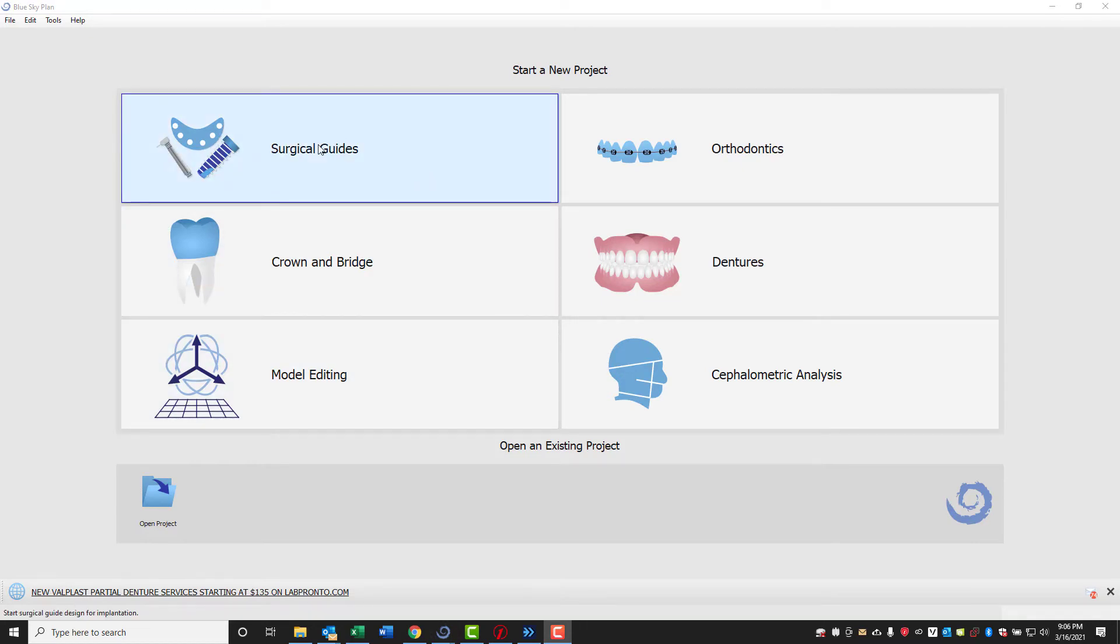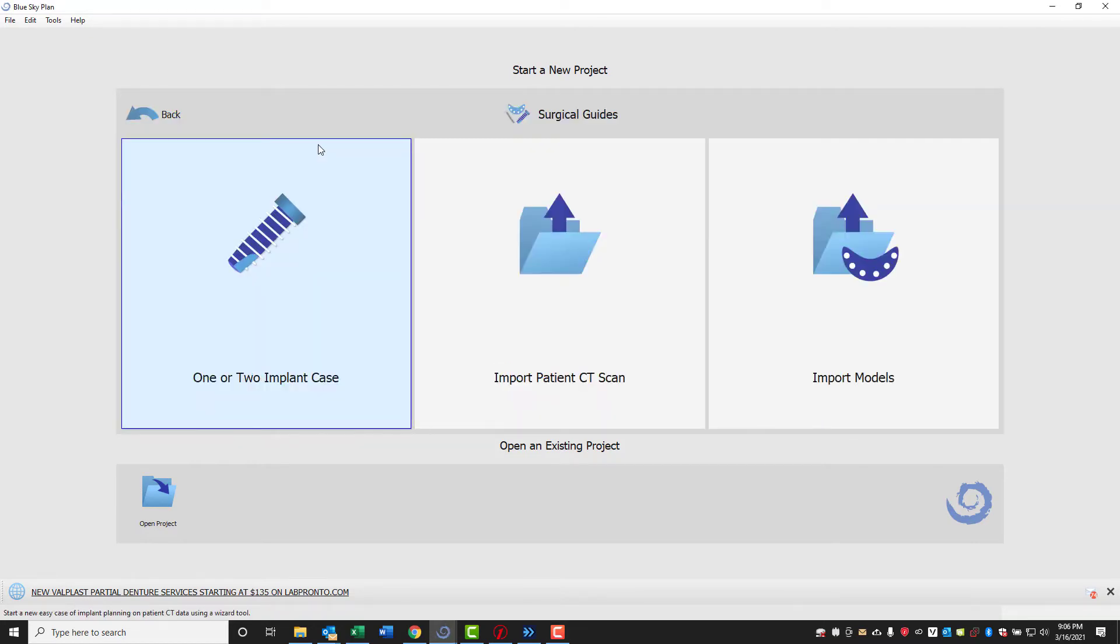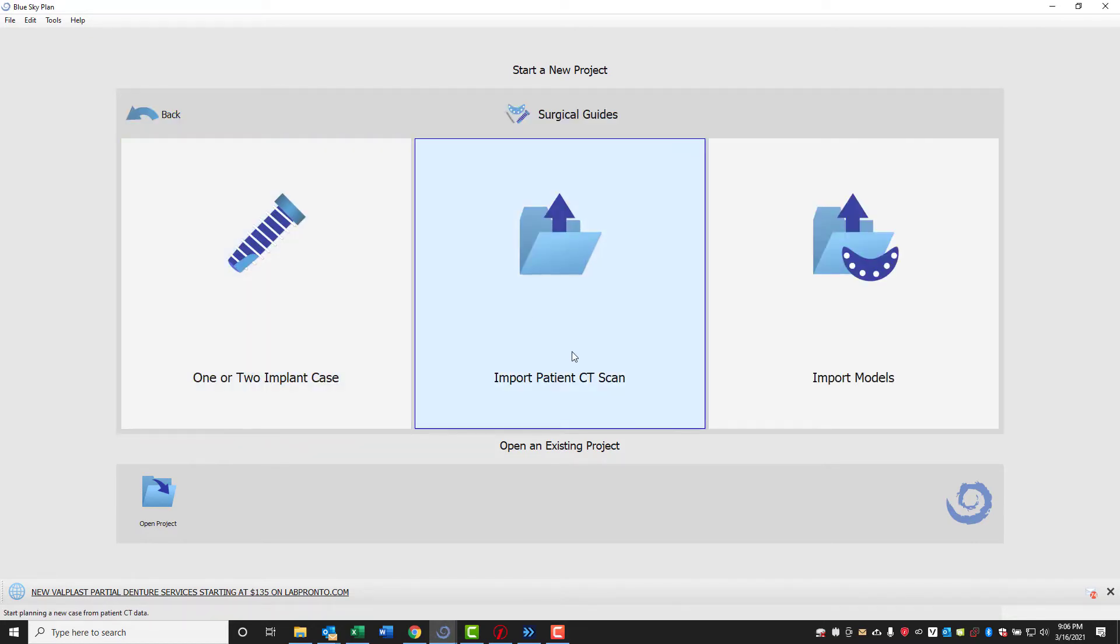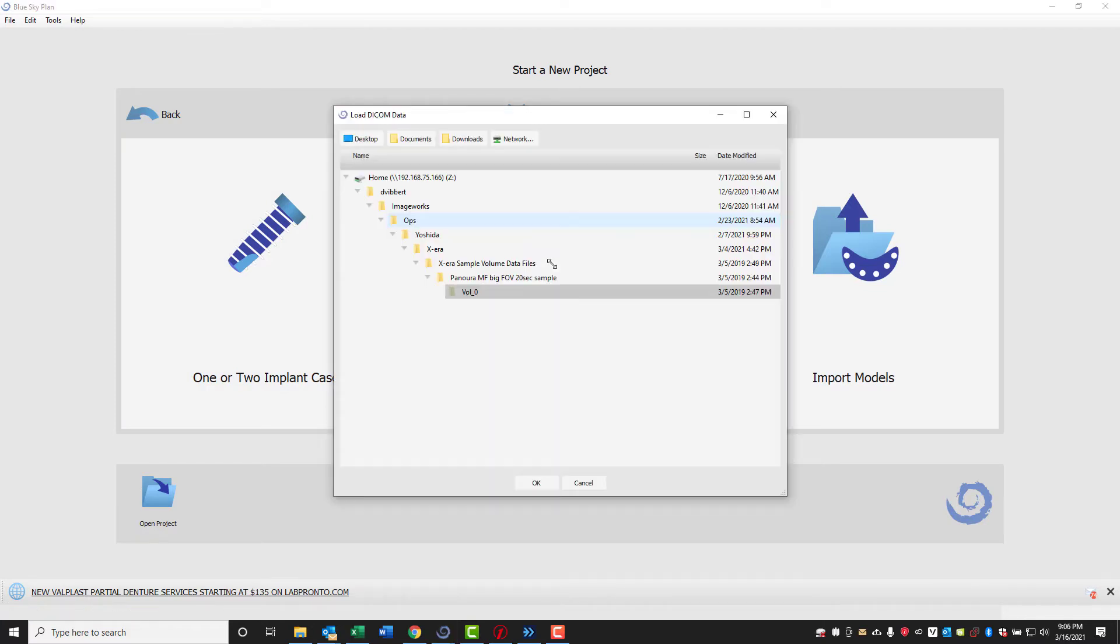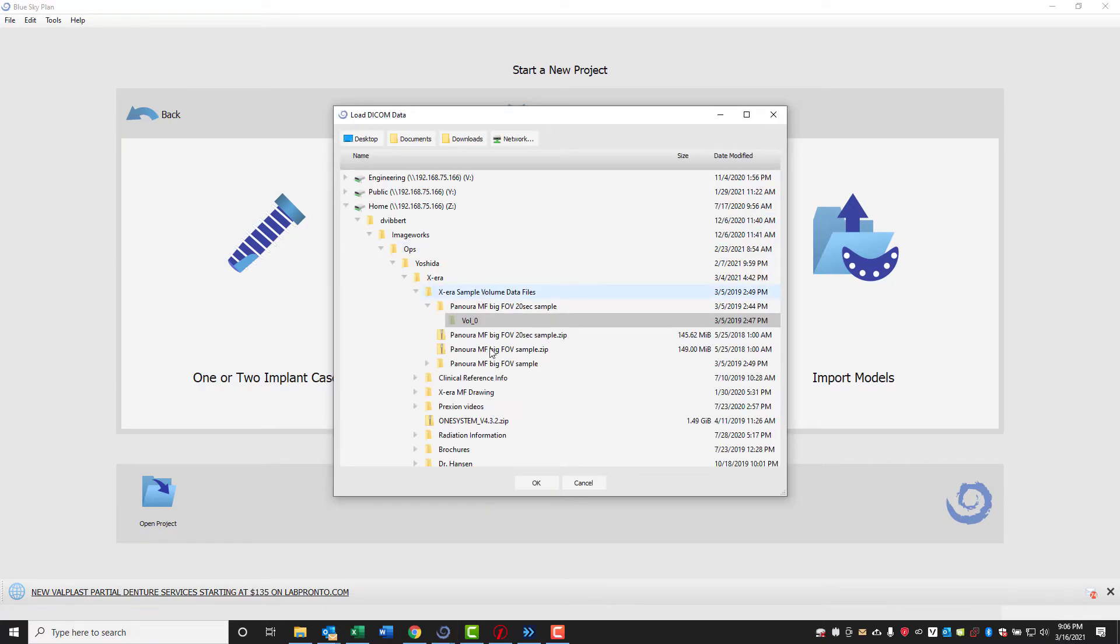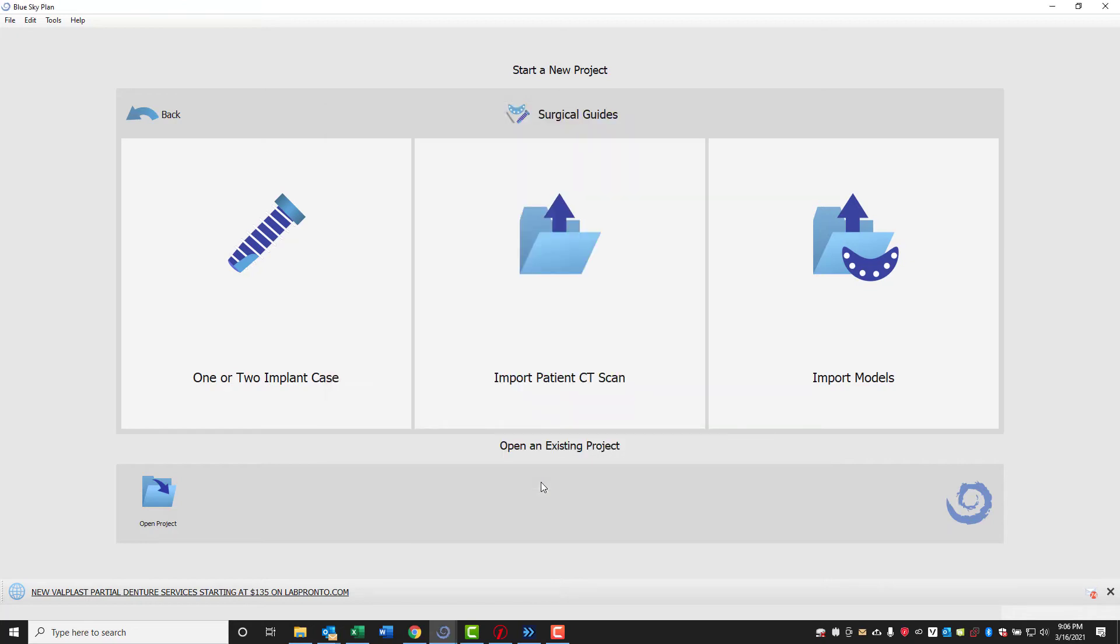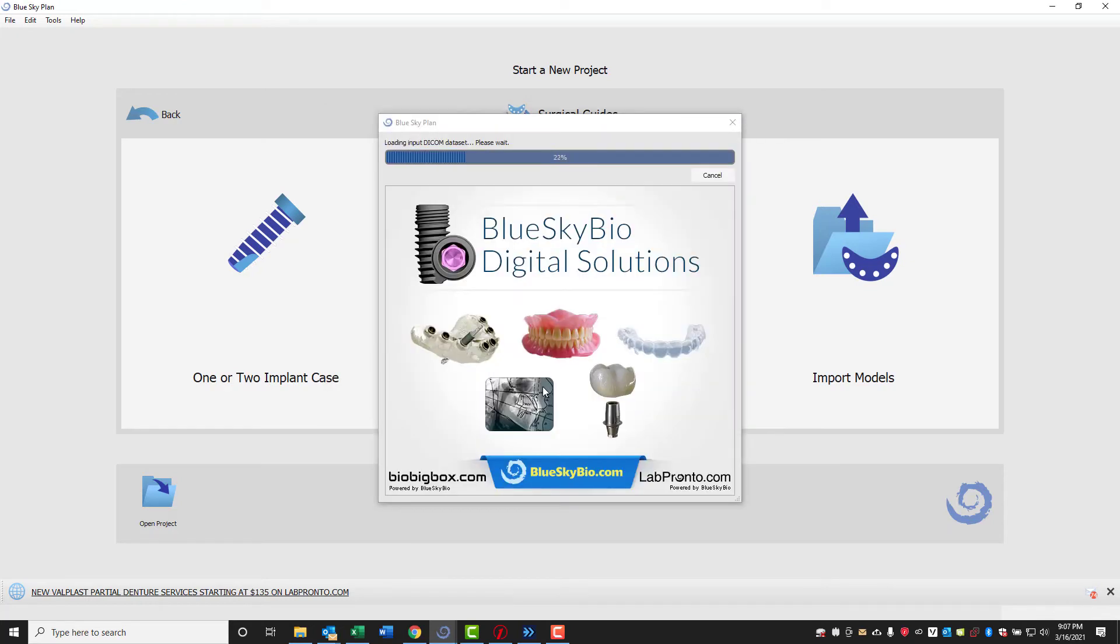We'll select to start a surgical guide project, and we'll click to import a patient CT scan. We'll select the volume that we're interested to import, and then we'll click OK, and the volume will get imported.